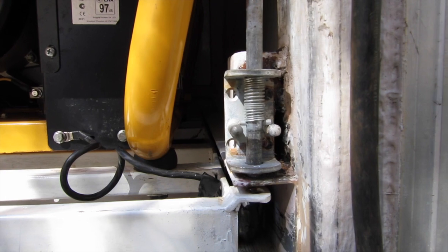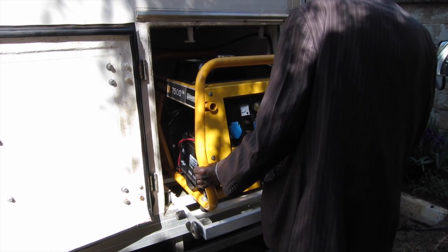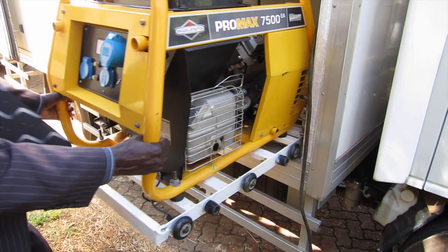Next, open the latch and pull out the generator. Once the generator is pulled out fully, engage the latch, making sure that it engages completely.